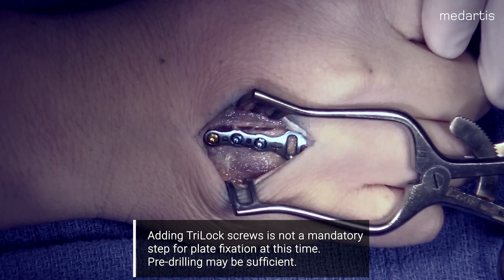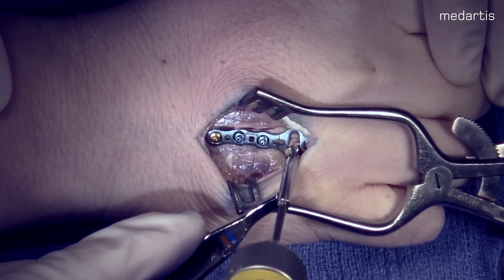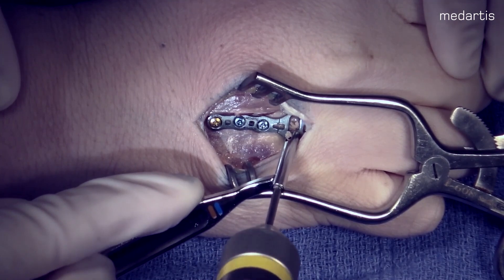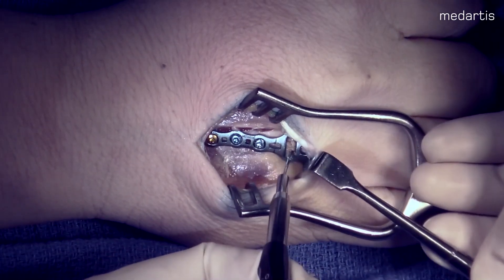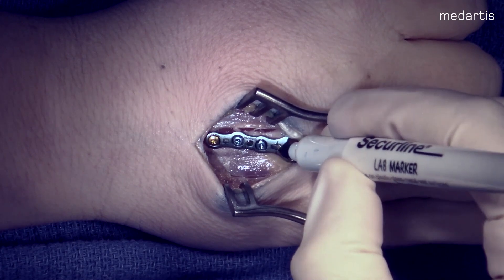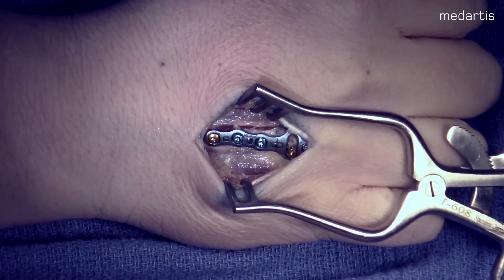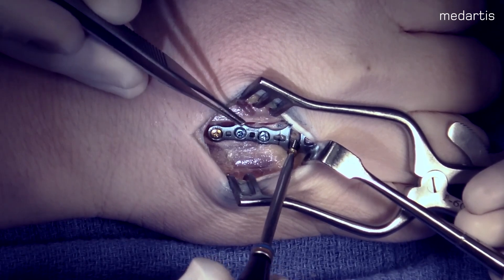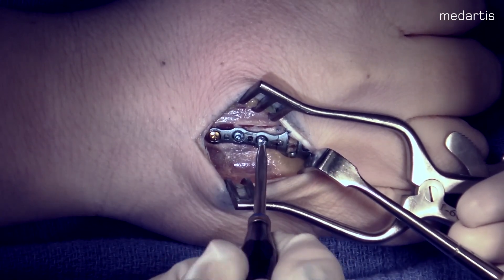After placing our proximal screws, we now progress to our oblong correction hole. Here we will drill and place the screw on the ulnar border of the oblong hole in order to externally rotate this digit for internal rotation deformity. Now that the plate is placed in the appropriate position, we are going to use a marking pin or a bovie to designate the osteotomy site. You can see on the plate there is a laser line to designate the osteotomy site. Note that I try to keep the order of the screws in reverse order of placement, making it easier when you replace the plate after the osteotomy.